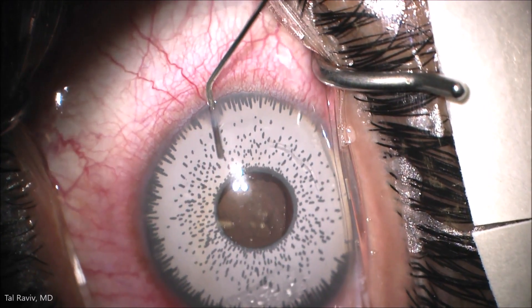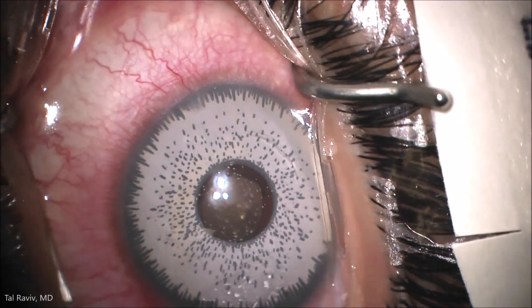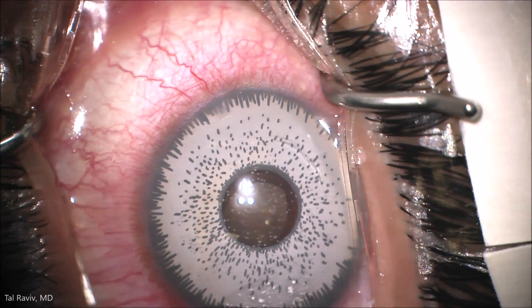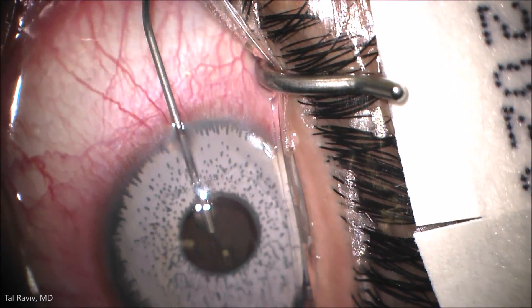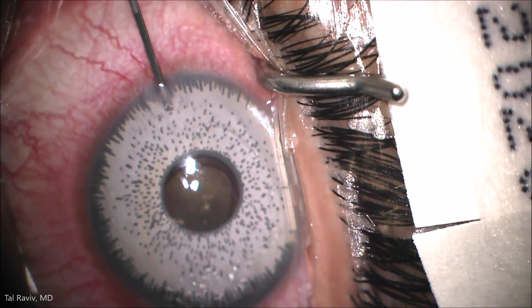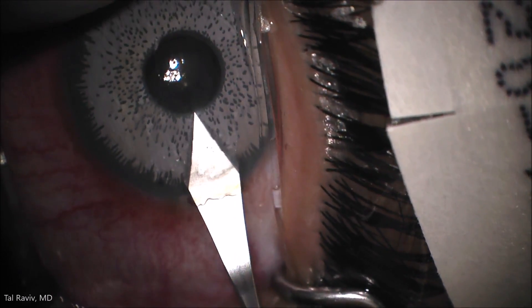I first place Miochol in the eye, which will constrict the brown colored pupil. You can see the irregularity of the pupil already as it's not coming down uniformly. The patient also had some cataracts. I place a dispersive viscoelastic to protect the corneal endothelium, and a 2.75 mm incision is made.